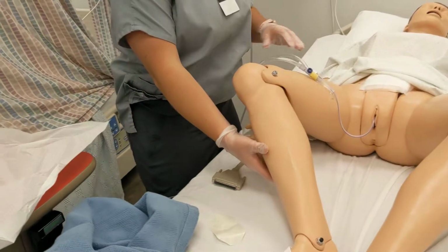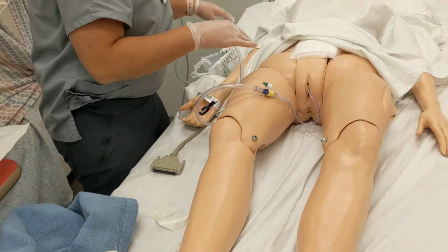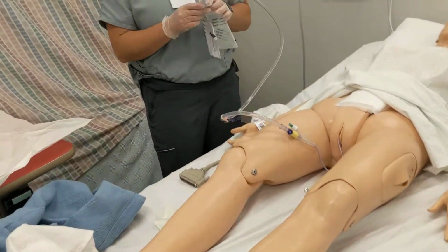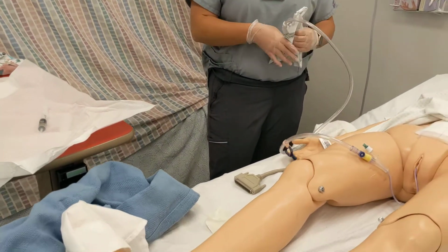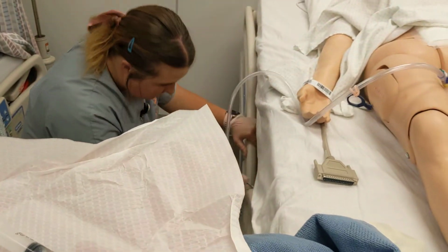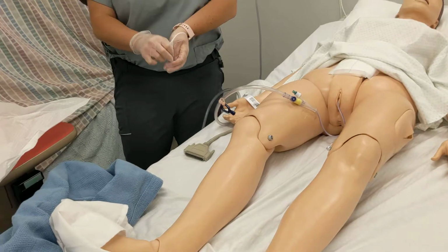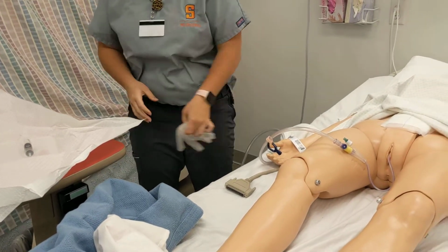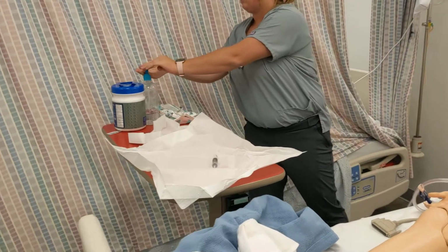I could help them back to a comfortable position with their legs. I'm gonna hang this. I do not want to hang it on the bed rail, so I'll put it on the frame of the bed below the thigh. So I see what's down there now. Take that off. Do hand hygiene.